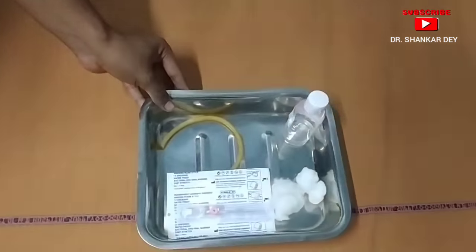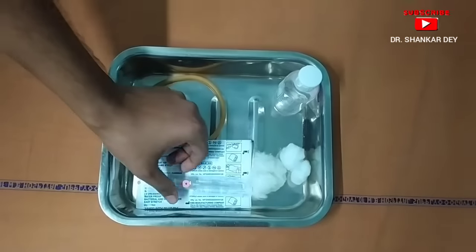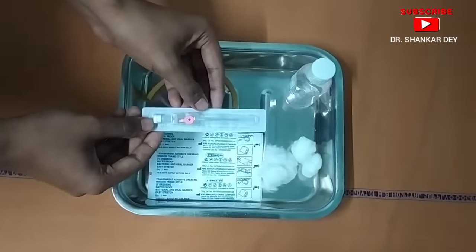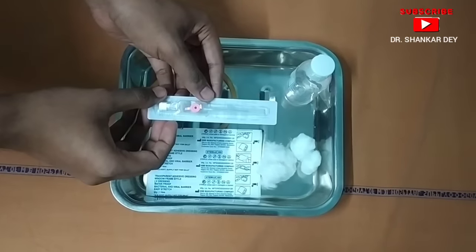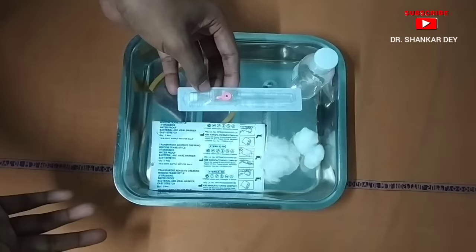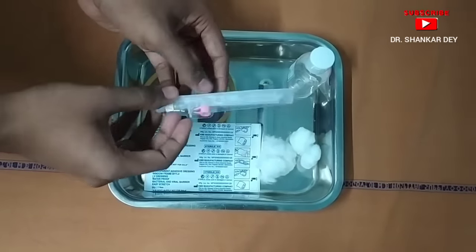First of all I am going to show you all the necessary things required for the procedure. Here is my tray with all the necessary items for IV cannula insertion. Here is one IV cannula — a pink or 20-gauge cannula. According to your need you can choose an appropriate size cannula, like 18-gauge, 20-gauge, or 22-gauge.